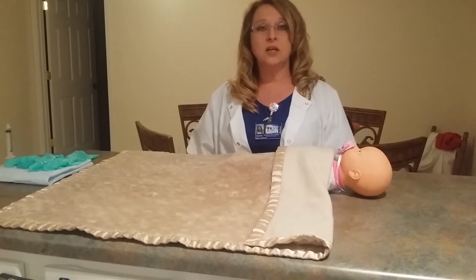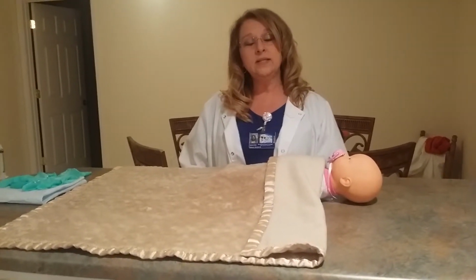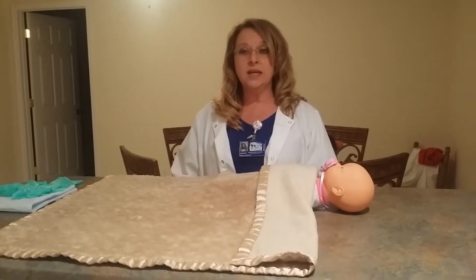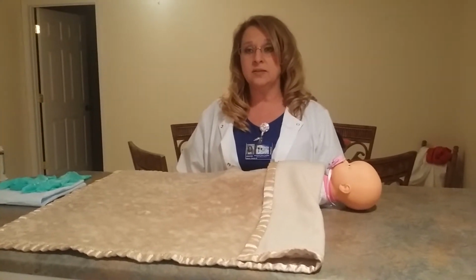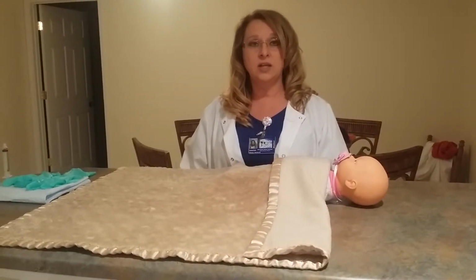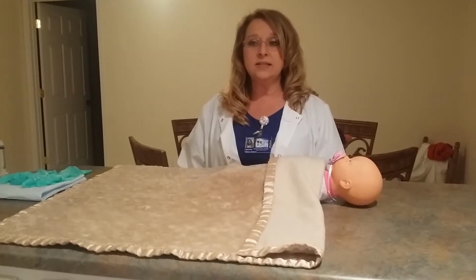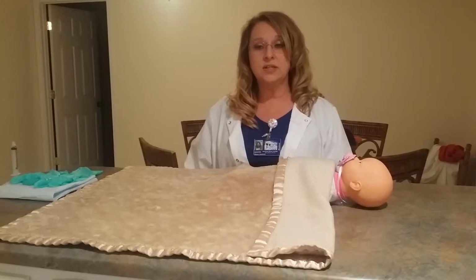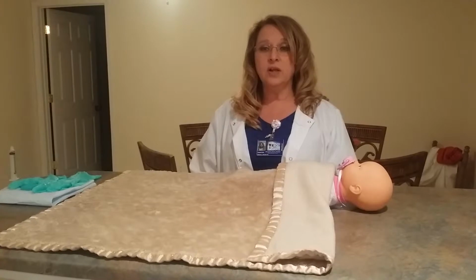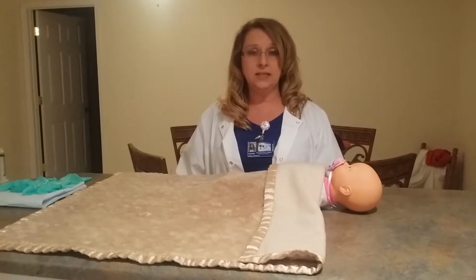This will help to prevent catheter-associated urinary tract infections, or CAUTI as they are known. CAUTI is a hospital-acquired condition with payment implications because it can be reasonably prevented using best practices. Be sure to follow CAUTI prevention practices such as performing hand hygiene prior and after Foley manipulation, maintaining a sterile, continuously closed drainage system, maintaining unobstructed urine flow, and emptying of the collection bag and discontinuation of the catheter as soon as it is no longer clinically indicated.